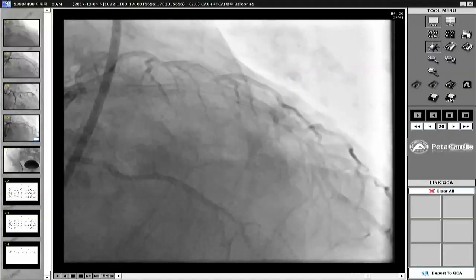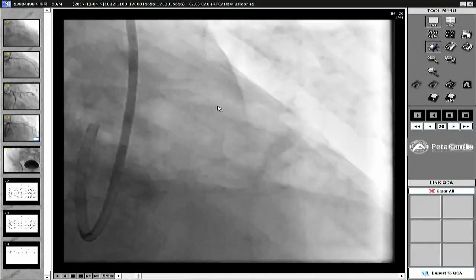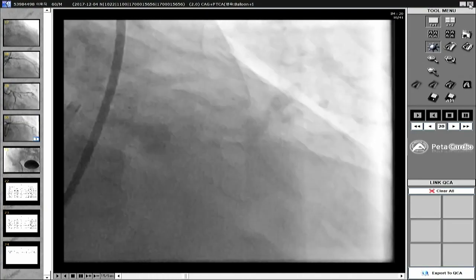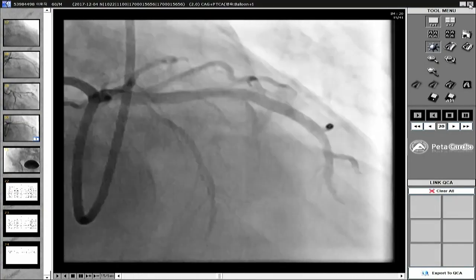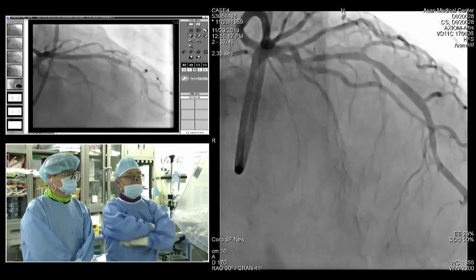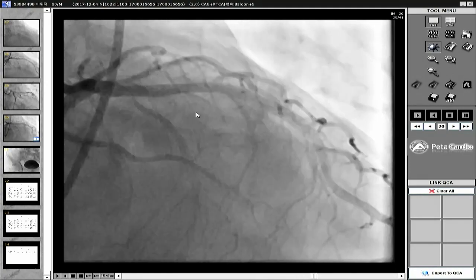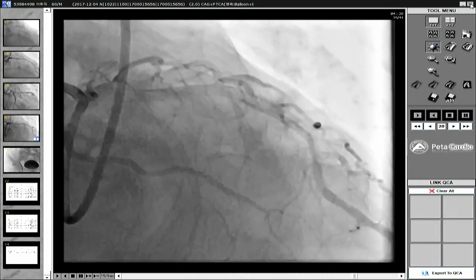Okay, two years ago, this patient underwent BRS implantation, and at that time we did aggressive predilation and sizing on the basis of IVUS, and post-dilation using a 3.5 non-compliance high-pressure balloon. Professor Kang, can you show us the initial immediate post-angio and OCT findings from two years ago? Yes, this is the angiographic image after implanting BVS 3.0, and we applied the 3.5 NC up to 20 ATM to make an optimal PSP for BVS.